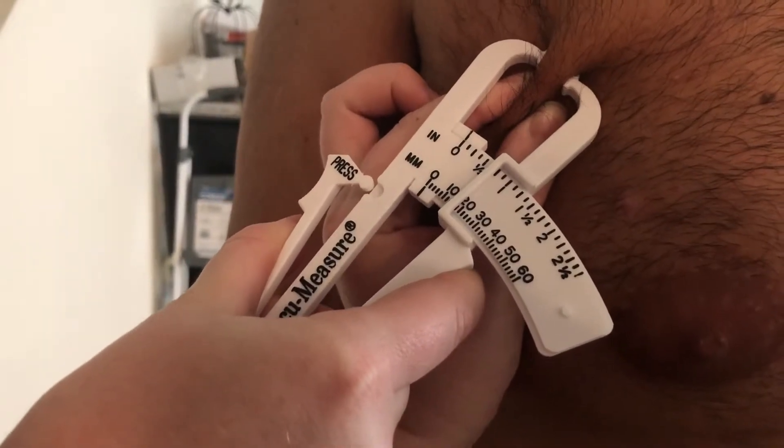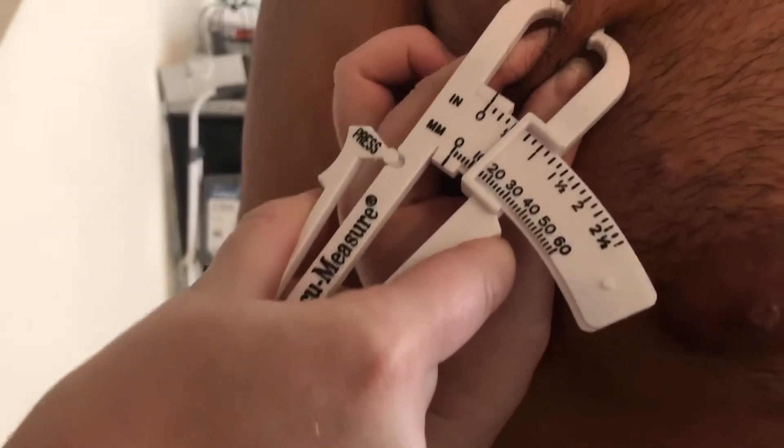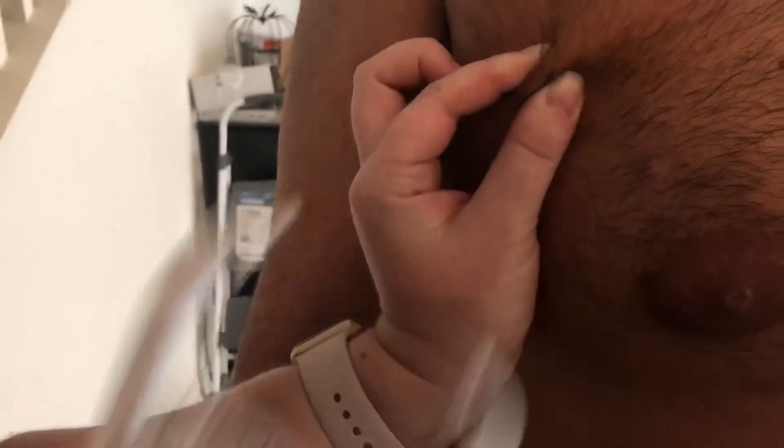I'm gonna go ahead and take the measurement right here, which is about close to one and a half inches.